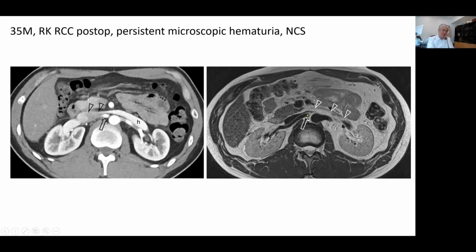And if the patient has hematuria or proteinuria of unknown origin, then please include these findings in your interpretation for the patient's microscopic hematuria or proteinuria in your reading report. Your report, including that information, may be very helpful to your referring physician and the patient.